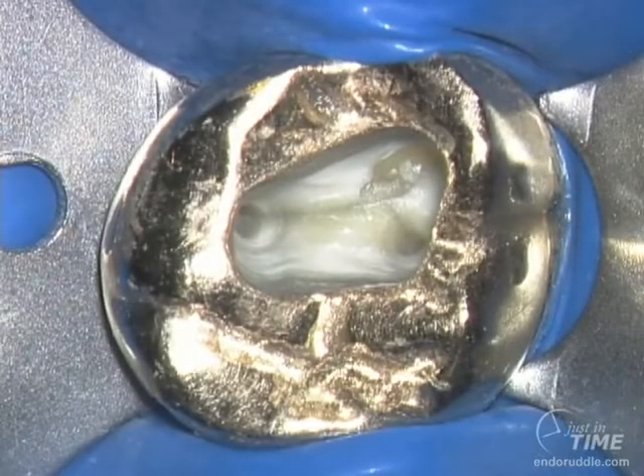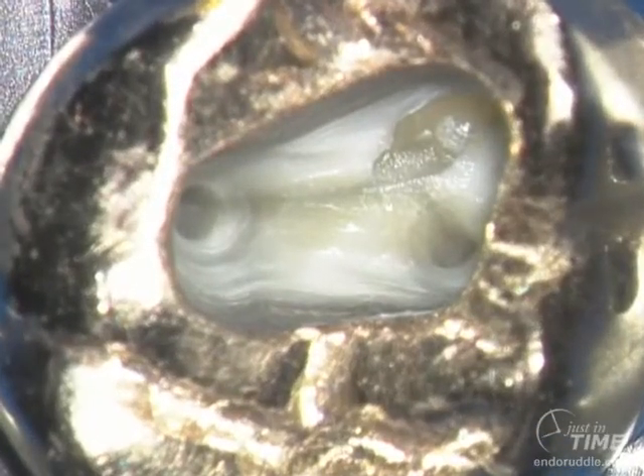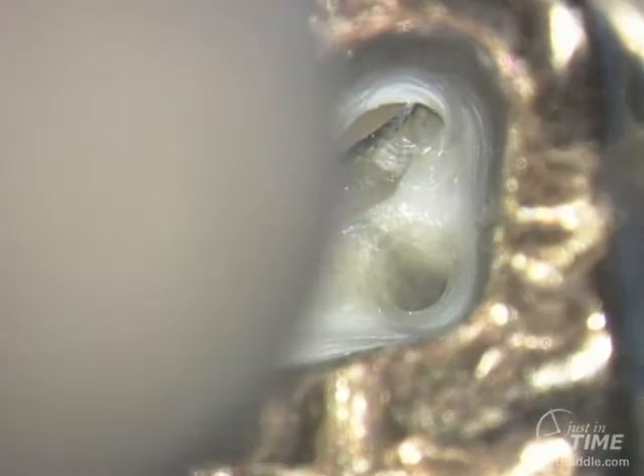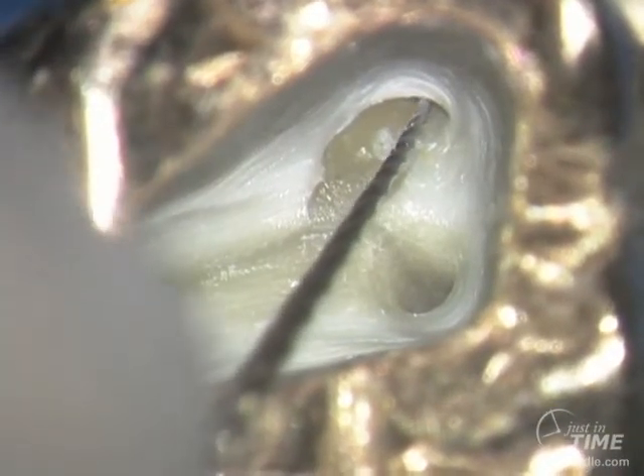A lot of colleagues would look down into this photographic image, into the pulp chamber, and say they're ready to begin cleaning and shaping. But to me, the access cavity, although it's a nice start, is still deficient. By placing hand files into the orifices, you can begin to interpret the entry angle of the canals as they enter into the pulp chamber.